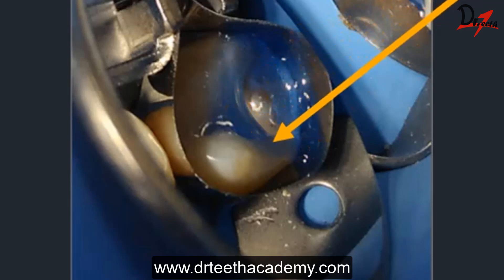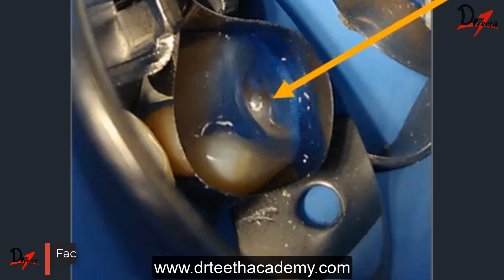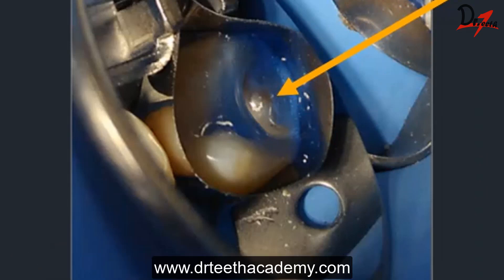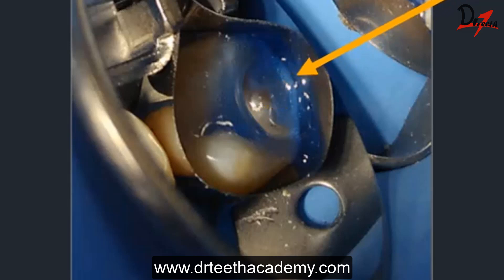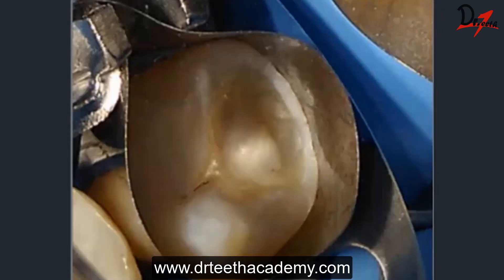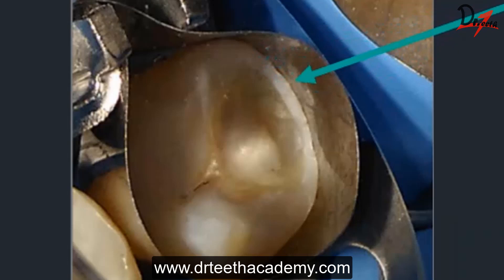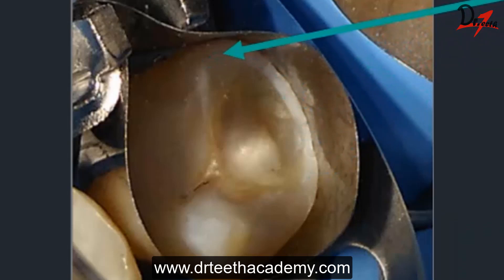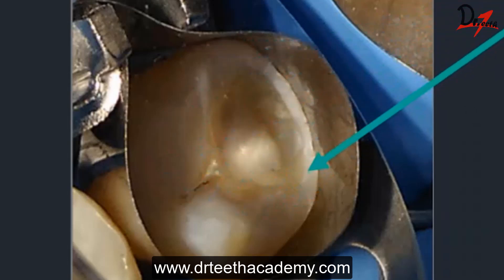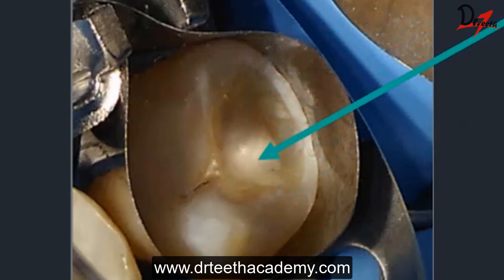After the matrix was adapted, I started the acid etching process. I etch along the periphery for 15 to 20 seconds, then etch the dentin for 5 to 7 seconds. Enamel needs to be etched more than dentin because dentin is much more sensitive and has less mineral content — we don't want to over-etch it. Once acid etching was done, I did rinsing. You can now appreciate that my matrix adaptation along the proximal wall is tight and rock solid, and you can see the dry frosty appearance of the enamel after etching.